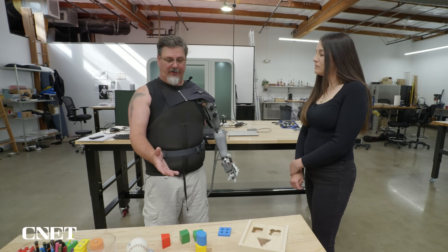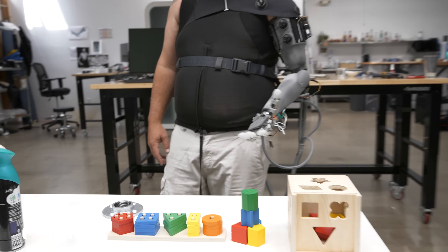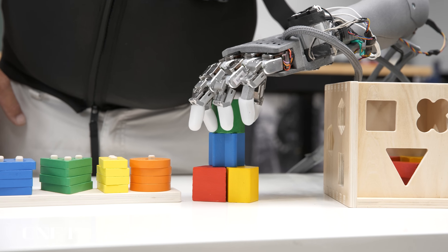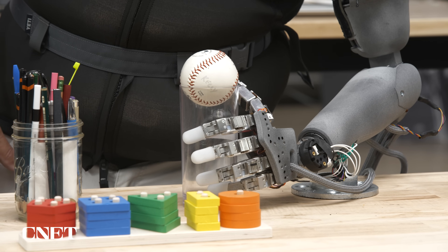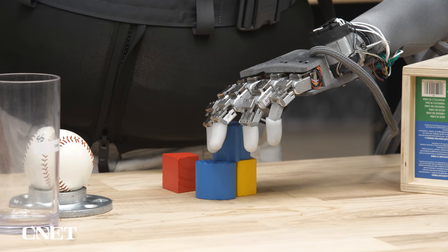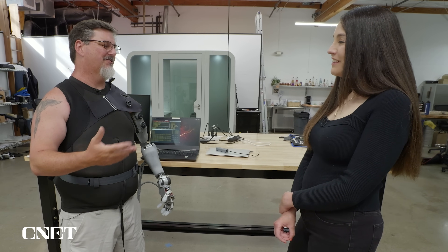When I go to pick up a block, I am thinking about each position before I get into it. I have to think about where my elbow joint is, then rotate my wrist before I reach over to grab the block. Once I level and get that accurate, I can go ahead and squeeze my hand or just think of a hand-closed gesture until I pick it up. I can move the wrist up and down, which is really important for grabbing a glass of water — I don't have to contort my whole body. I'm feeling my actual fingers do the work and it translates into this motion. It's a satisfaction you just can't explain. It's something I've lost for 12 years and now I'm finally getting it back.